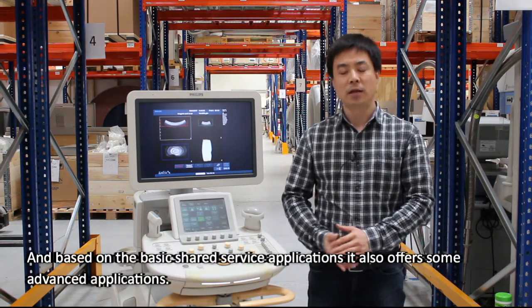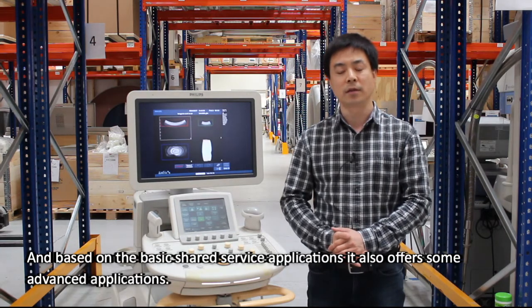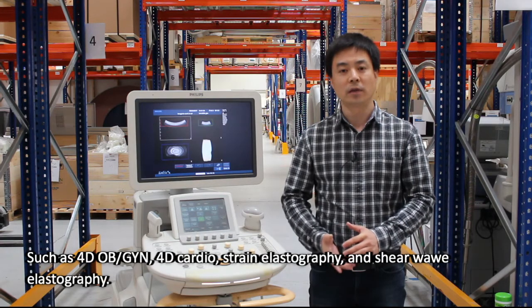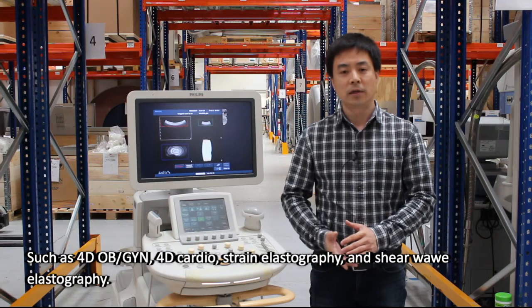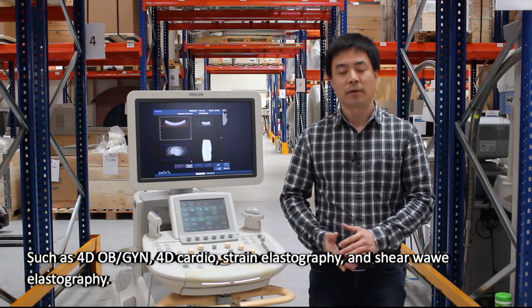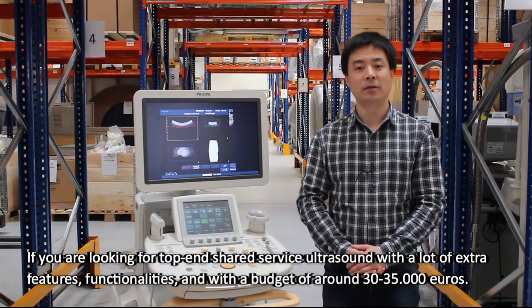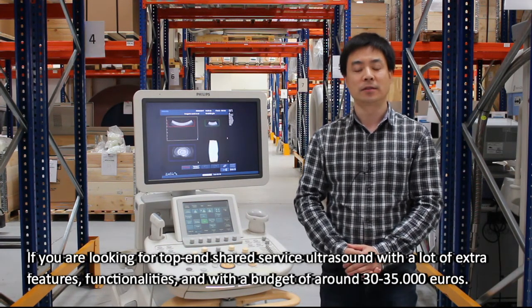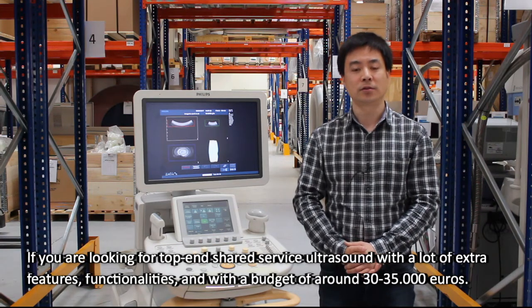Based on the basic shared service applications, it also offers some advanced applications such as 4D OBG, 4D cardio, strain elastography, and shear wave elastography.